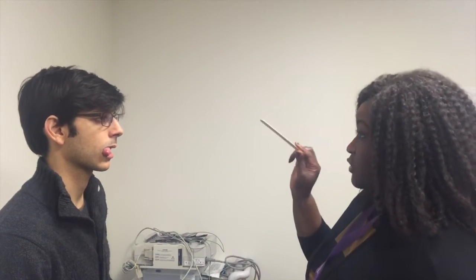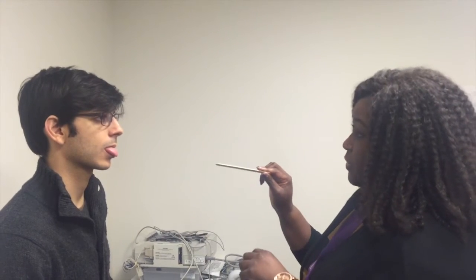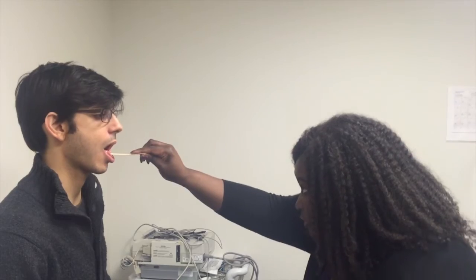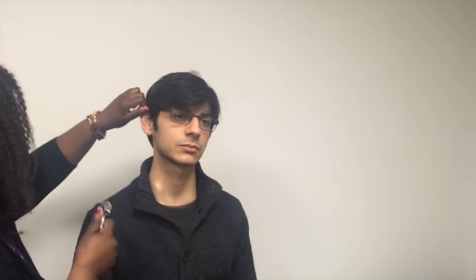Good. Now I'm going to use this tongue blade. I'm going to ask you to open up a little wider. I'm going to depress your tongue and say ah for me. Ah. Very good. So I'm just taking a look in the ear. Any tenderness when I touch? No. Okay.